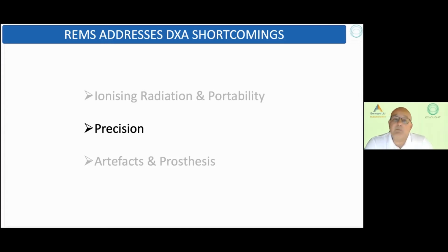Of course, the other thing that we struggle with DEXA is actually using it for screening or monitoring. Both of those will actually cause the requirement of multiple scans. Now, DEXA scans aren't repeated more than every 18 months to 2 years. That's reported as it's radiation, so we cannot use it until we know that we have something to measure with it, and that's all to do with the precision. It's the precision of the equipment that is limiting to the number of times it can be used, because radiation cannot be applied without a good chance that you'll get an outcome from that.